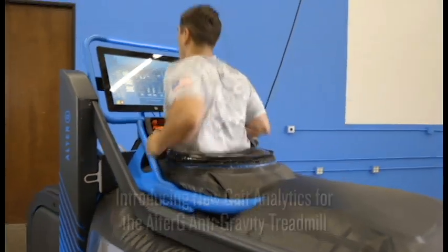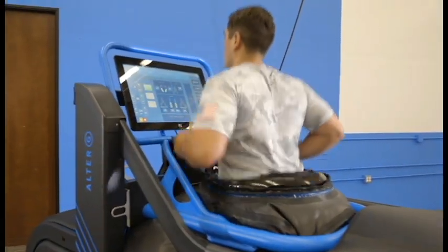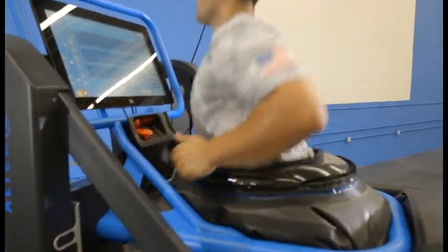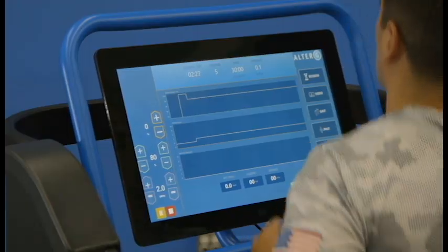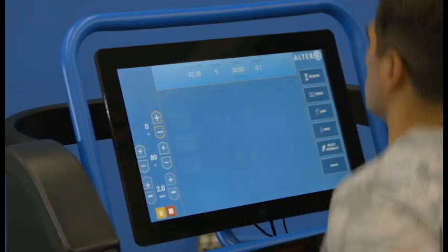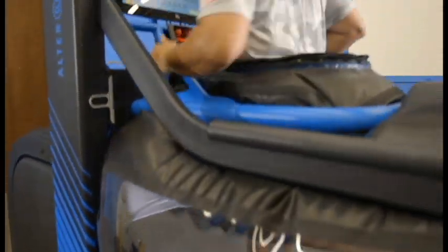Introducing VIA, the new anti-gravity treadmill from Alter-G. Leverage the power of objective data to see direct effects of precision unweighting using differential air pressure technology.